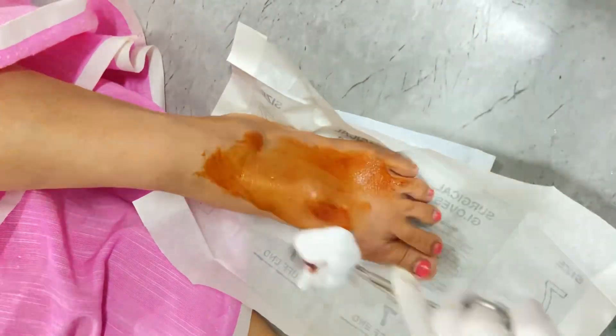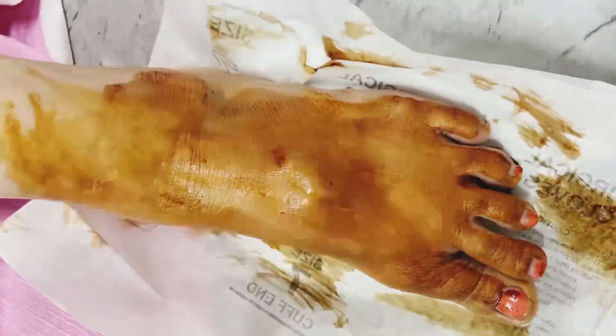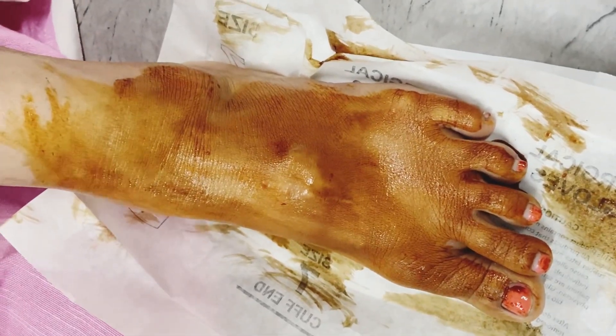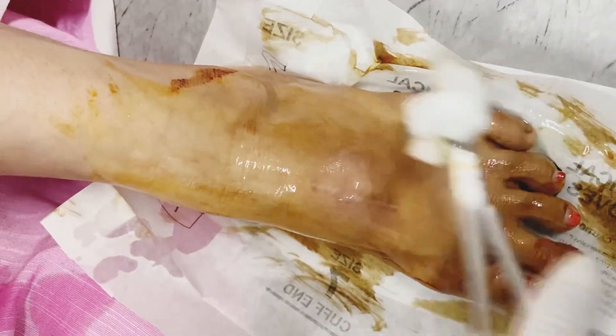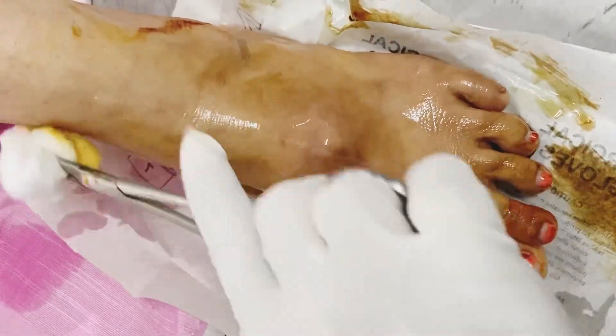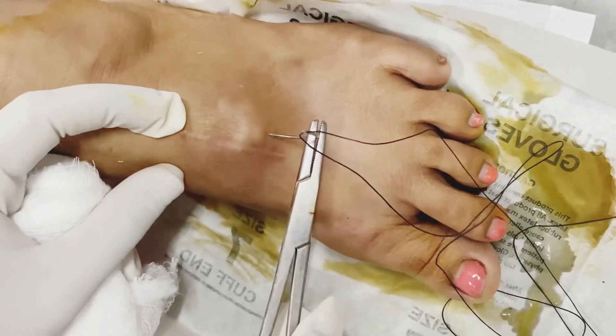Hello viewers, today in this video I will demonstrate how to manage ganglion cysts by threading technique. Today my patient is a 30-year-old lady with a big size ganglion cyst over the dorsum of foot. After cleaning the site with povidone iodine and spirit, the cyst is stabilized.